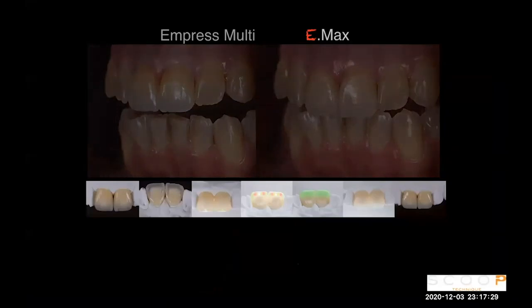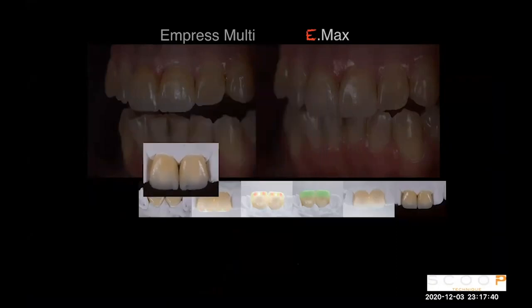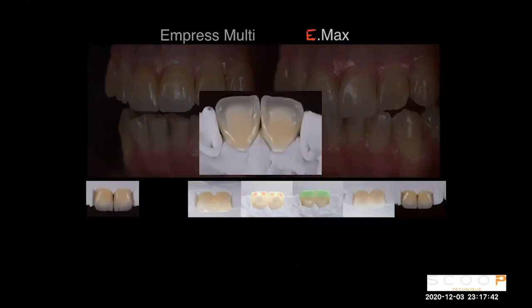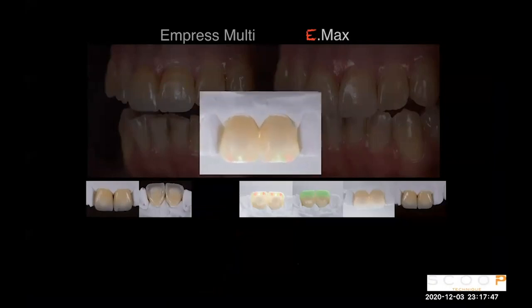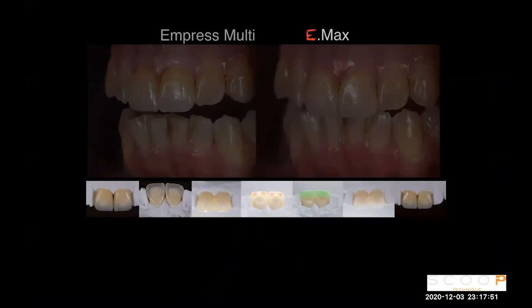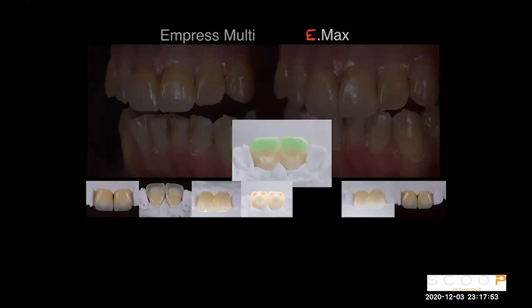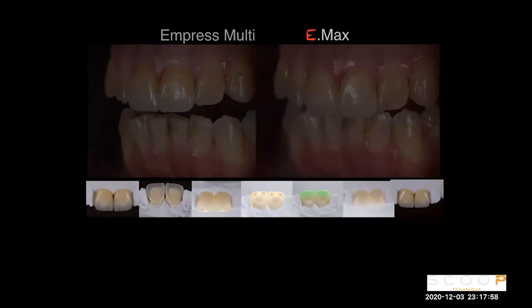So this is step by step. You can see how much translucency we can create from palatal. And remember, we need to finish the buccal side first. And then we need to start the buildup. Cover everything with enamel. And here is the translucency of the restoration. Here is the case done.